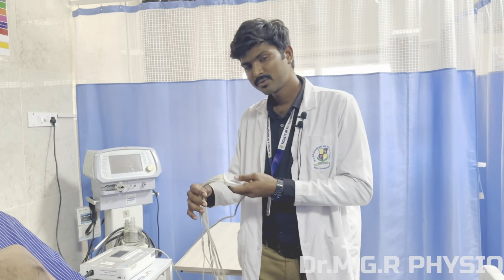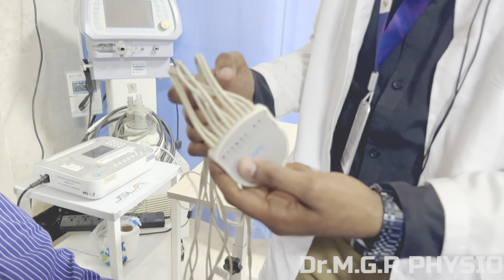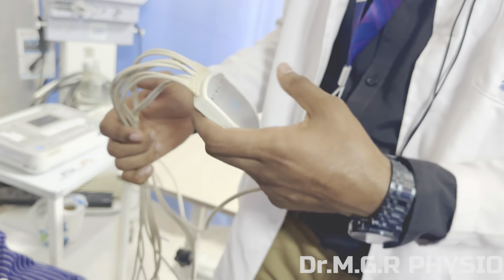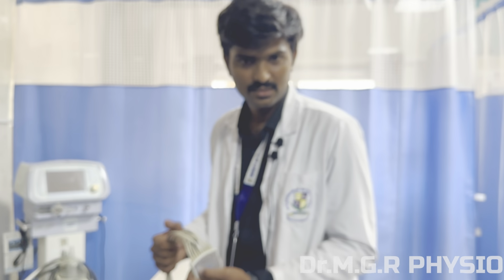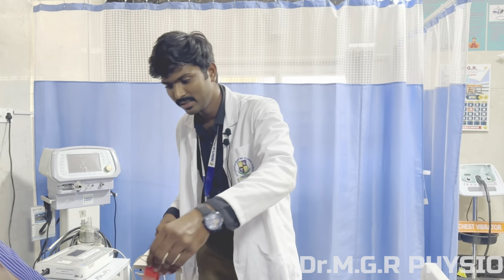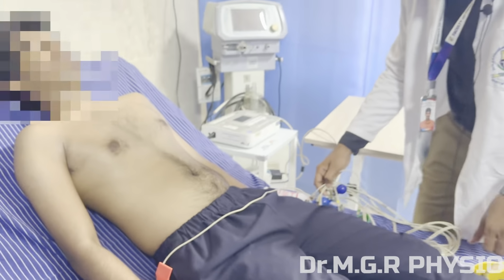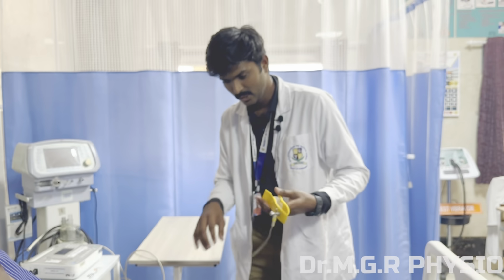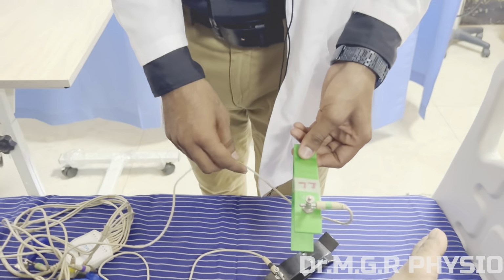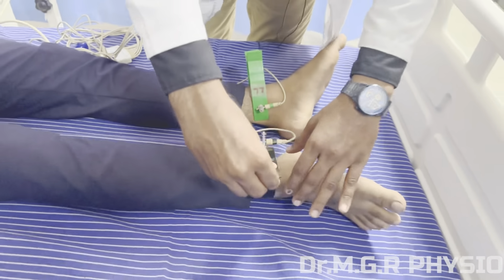We have two systems of lead placement: one is the AHA, the American Heart Association standard, and the other is the International Electrotechnical Commission standard, the IEC standard. This machine uses the IEC standard, wherein the red color goes on the right arm of the patient, the yellow color goes on the left arm of the patient, the green indicates the left leg, and the black is the neutral lead, that is the N, which will go on the right leg.